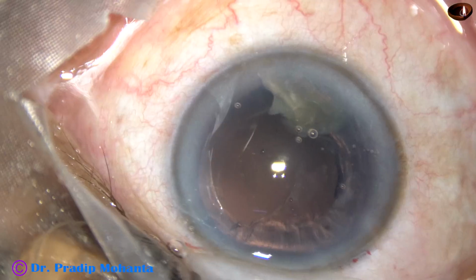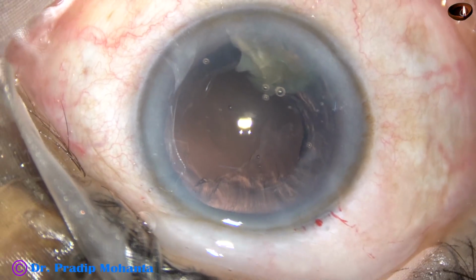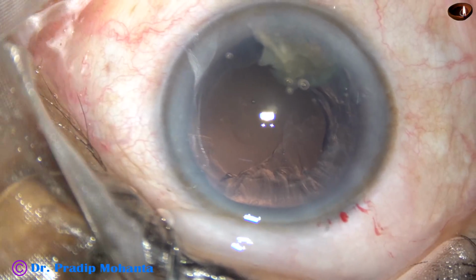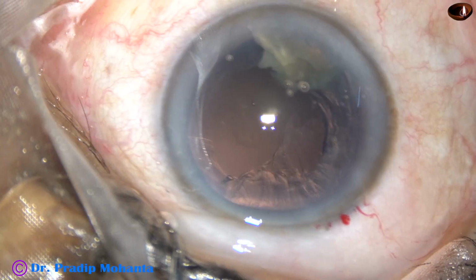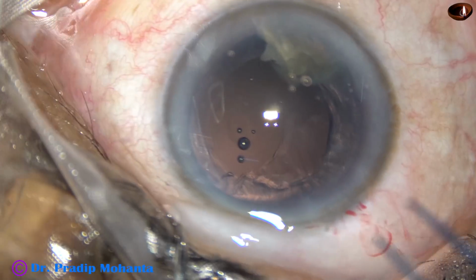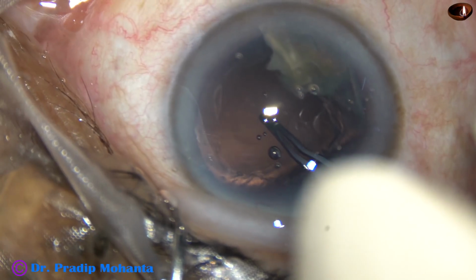Now how to manage this? Since I can see the rent very well, my plan is to convert it into a small round posterior capsular rhexis, and then I want to implant an IOL in the back.